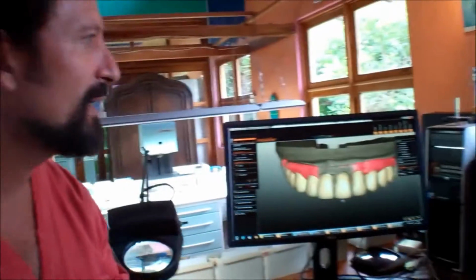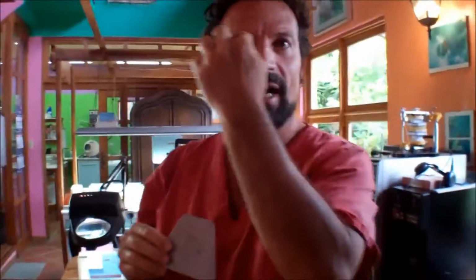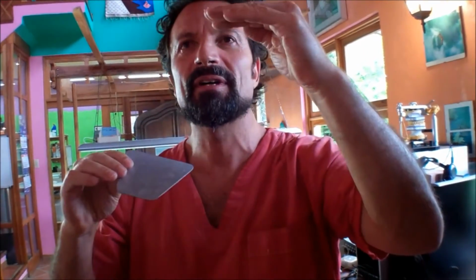Okay, I explain it to you with this. Okay, with the line between the two eyes, the center of the two eyes, imagine a line here, and this line has to be parallel with the front. I get you. Yeah, your difference. The upper has this, but the lower is going this way.